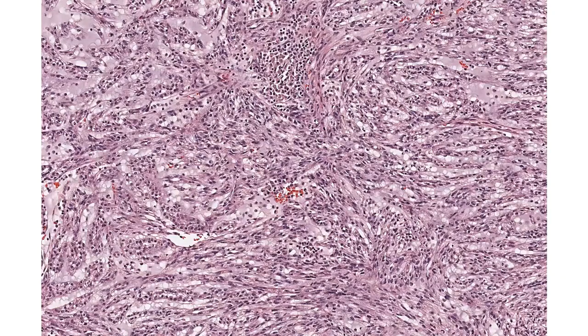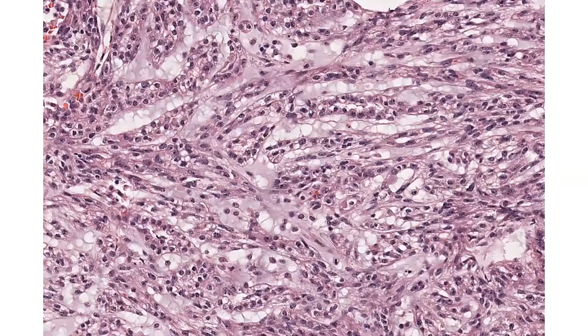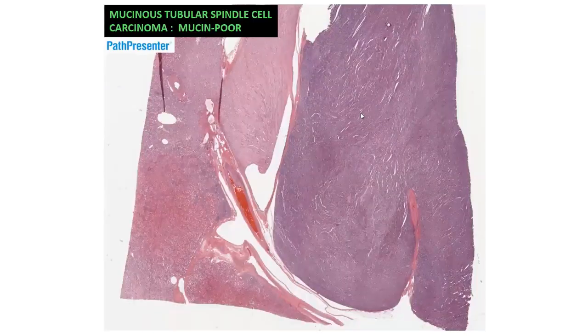So you get this spindle cell element, and as you can see, where the cursor is floating around, you get these stretched out elongated tubules which are lined by cuboidal cells. So this is the spindle cell element for you, short fascicles. The myxoid background can be well appreciated. And these are the tubular elements which are lined by the cuboidal cells with low-grade nuclear features.